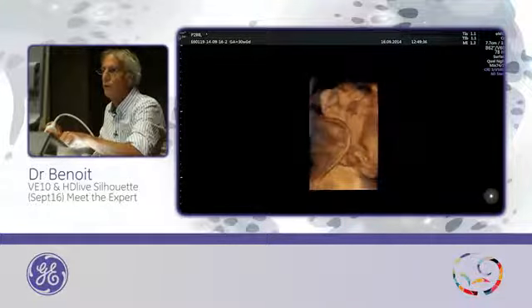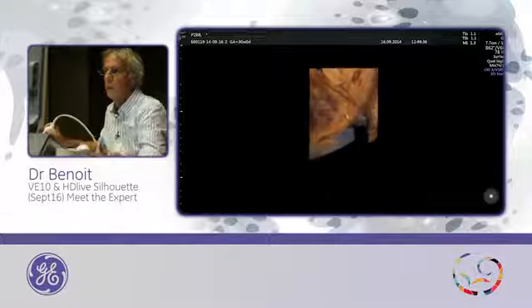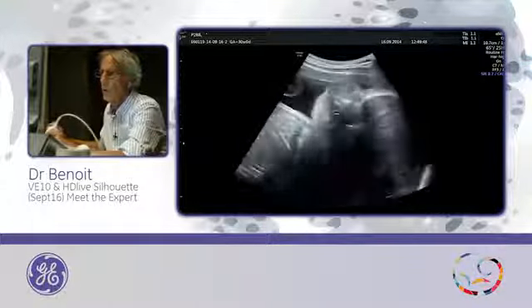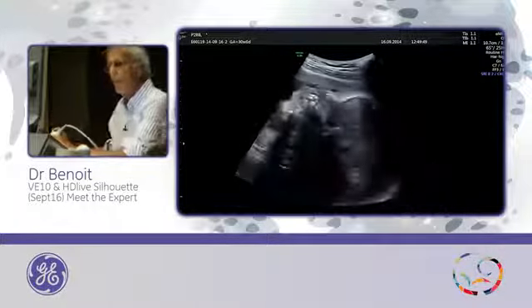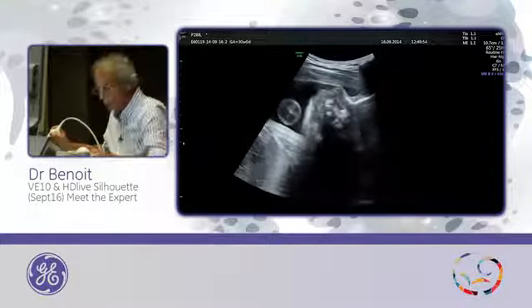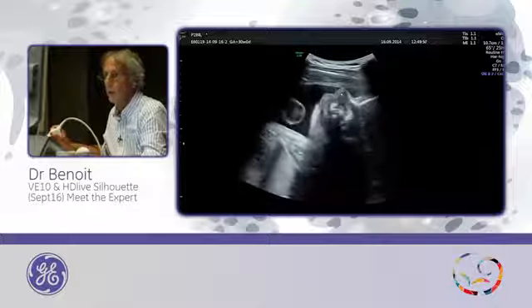I just have to rotate. And this is one ear. And I will show you how to use a new HDlive. So now the baby is not in the perfect condition for the 3D, for the face. Why? Because we don't have too much fluid in front of the face.